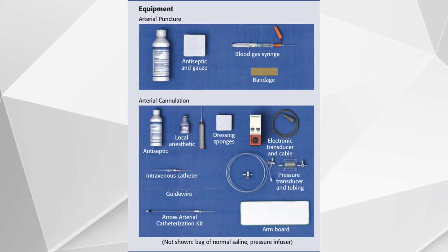Here you can see the arterial cannulation equipment: the armboard, the arterial catheter, the guide wire, the antiseptic, and the local anesthetic. We also have the transducer with the tubings, and the electronic transducer and cable that connects to the monitor.